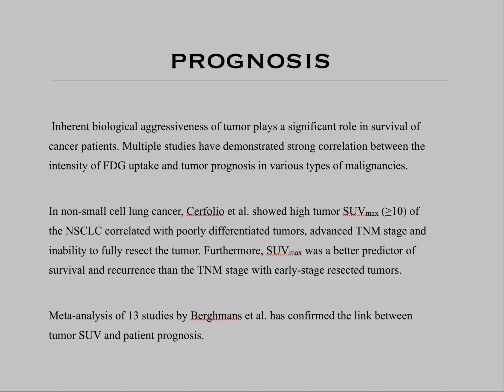It's also important to understand that in most tumors, SUV max correlates pretty well with the prognosis. So I really think one of these days that in lung cancer we're going to be suggesting mediastinoscopy and EBUS based on SUV max, because I know if I have a lung cancer with SUV max of 25, I know it has to be metastatic. However, if it's a lung cancer with SUV max of 2, there is no way it has developed metastasis in most of the circumstances.